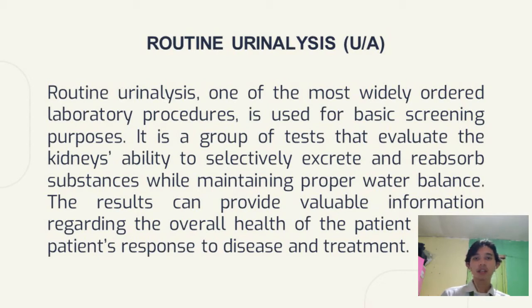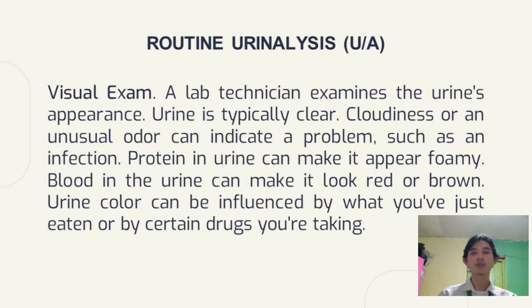It is a group of tests that evaluate the kidney's ability to selectively excrete and reabsorb substances while maintaining a proper water balance. The results can provide valuable information regarding the overall health of the patient and the patient's response to disease and treatment. So for the visual exam, a lab technician examines the urine's appearance.